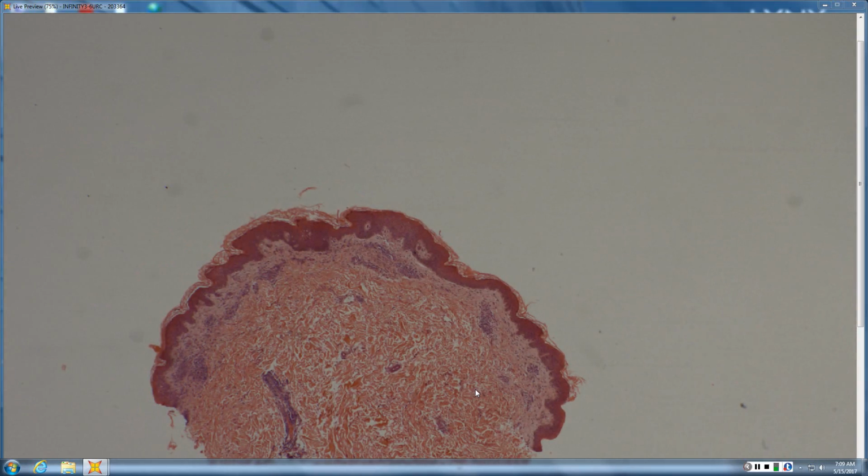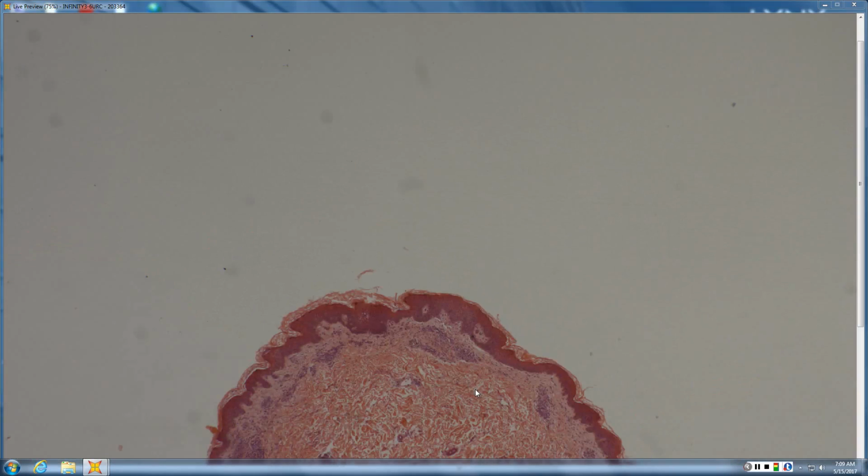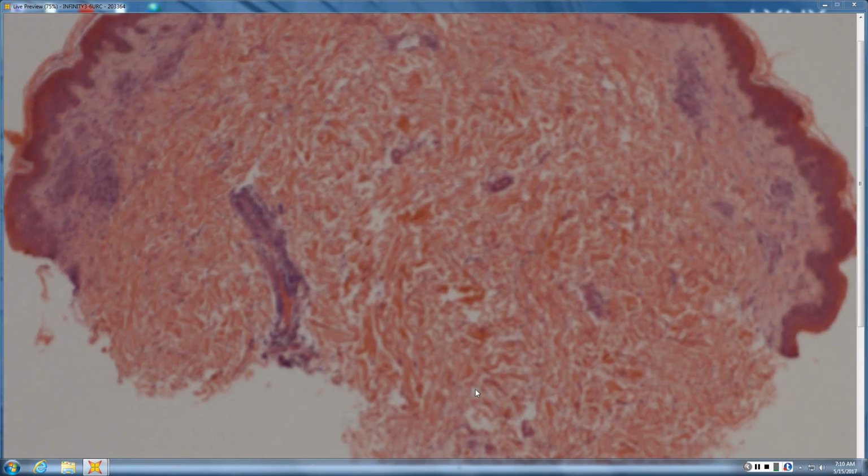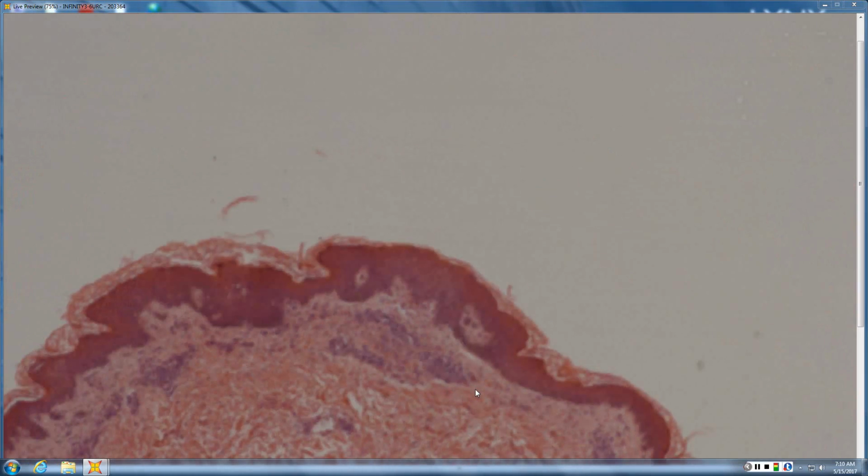Let's see, this one was Morbilliform drug eruption. And I guess this one's good because it highlights how it can be frustrating both for the derms and the dermpaths with this sort of reaction pattern, because it's often nondescript. And here, it's maybe some subacute subtle spongiosis.